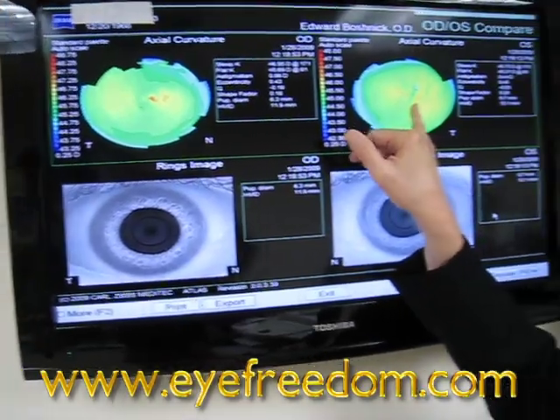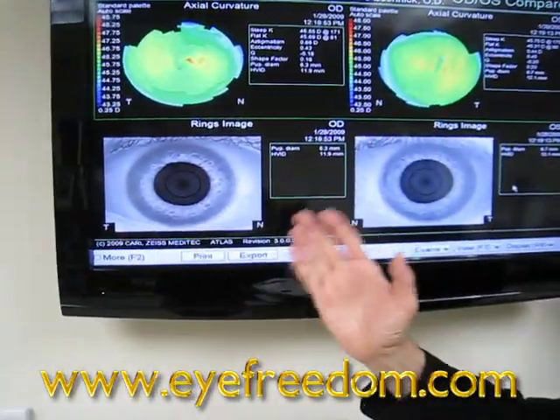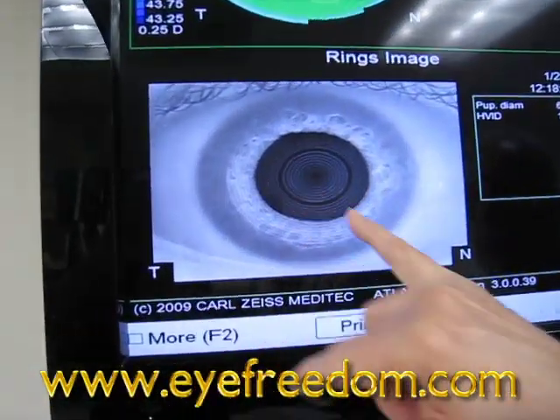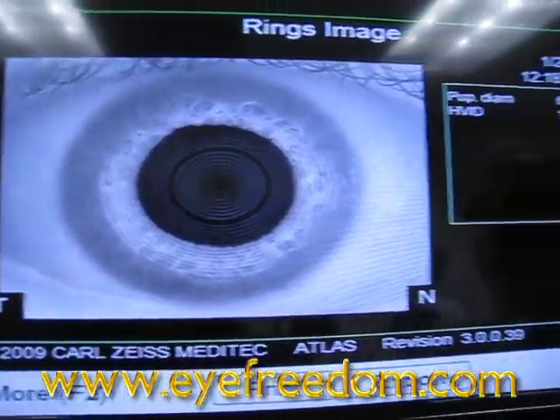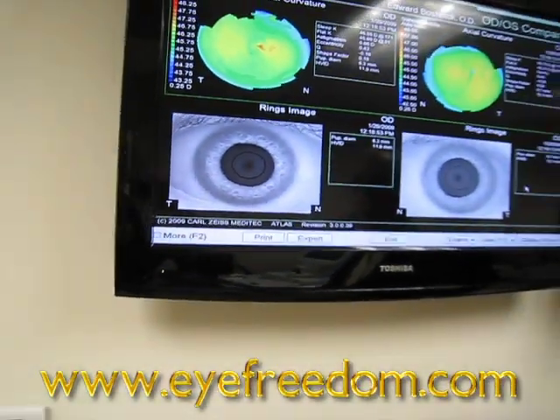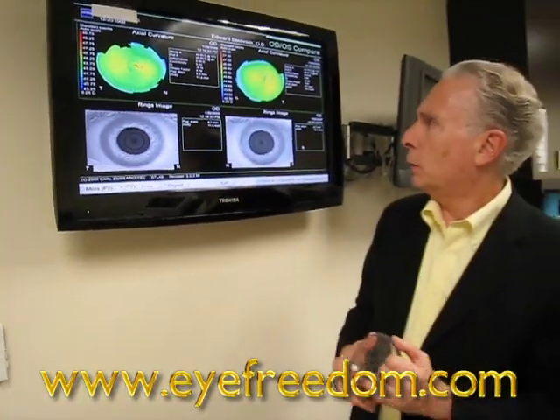Basically everything is nice and smooth. The patient does not wear glasses. You can look at the mires — the rings — perfectly round. This patient has 20/20 vision with a very small spectacle correction.